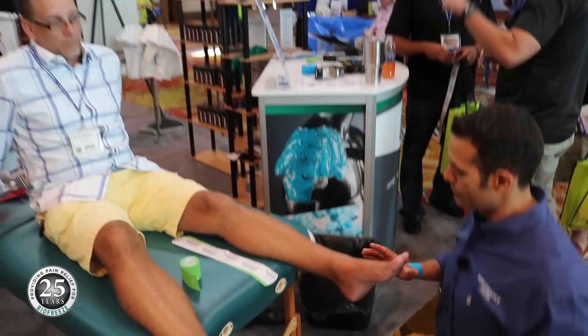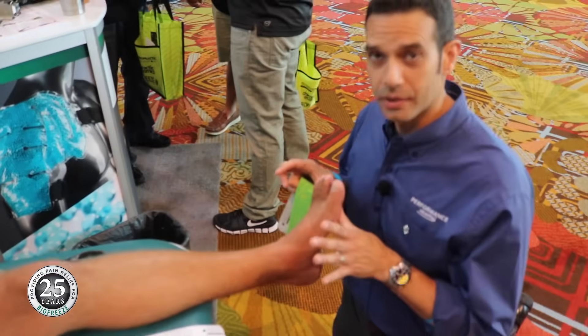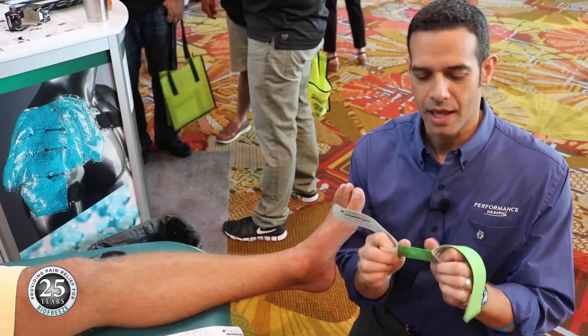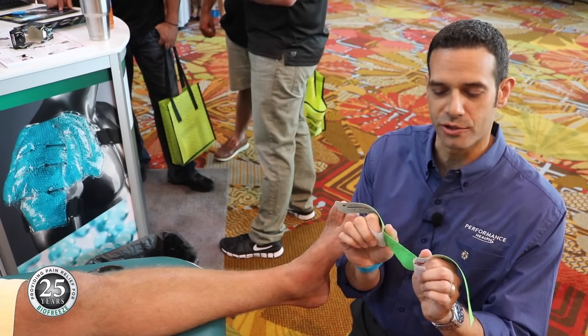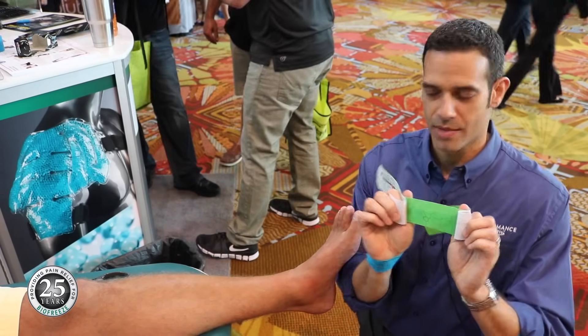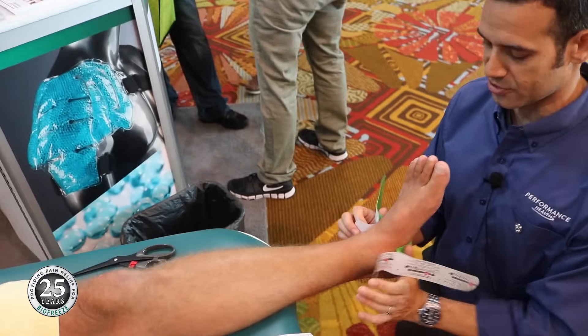The first strip is going to be associated with the talus and the ankle mortise, so we're going to put that foot up into a neutral talus position. We split the tape right in the middle — the easiest way to manipulate it is with your first and second finger grabbing the backing, and your thumb and first finger grabbing the tape and backing together. Now we just place that right onto the back of his foot and create some tension, making sure it's going to stick.